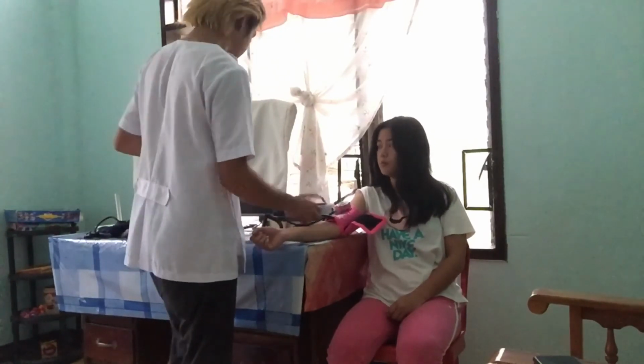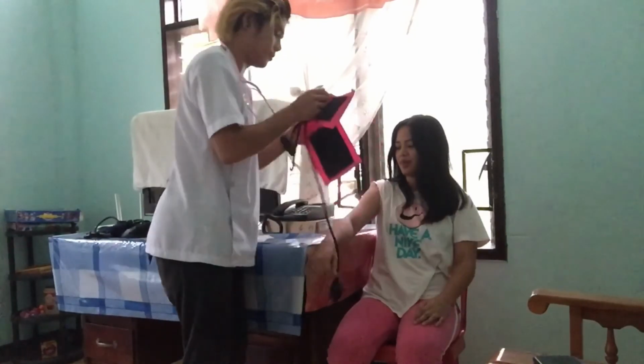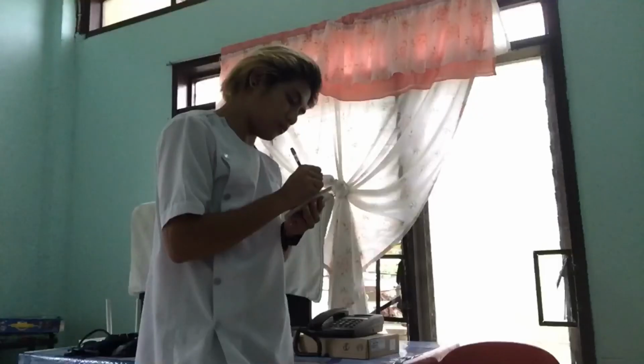measurement is taken. Position the patient comfortably, provide privacy and safety. After care of equipment, do hand washing and document vital signs.